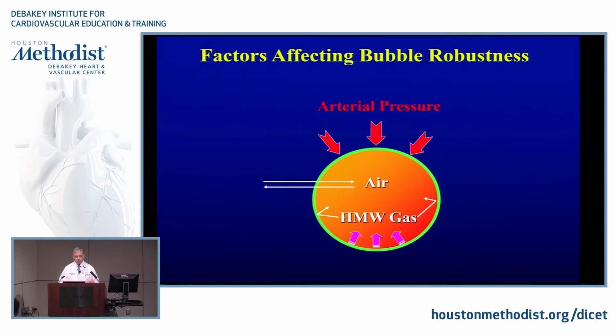So all what we're talking about here is that these tiny microbubbles, either generated through agitation or manufactured, basically scatter ultrasound. That's what they do. Remember from our first lecture talking about ultrasound, these waves, when they hit these tiny microbubbles, they have energy. So that energy vibrates the tiny microbubble, and it depends what the property of that microbubble is, what is the shell like, which is in green, what is the gas like, what's the half-life of this tiny microbubble, right? And what's the frequency from which you're sending? So all these interactions occur to provide this beautiful contrast, and how long does the contrast last, and how intense the contrast is, right? So we need to know all these intricacies, and I know this is not a novice audience. So we're gonna interact and talk and ask questions about that, because I think this is very important.